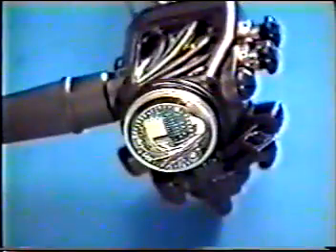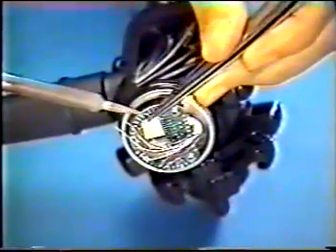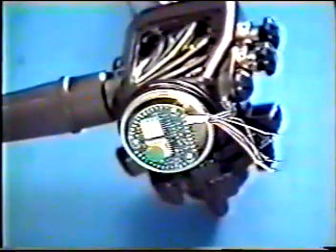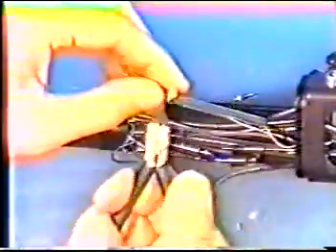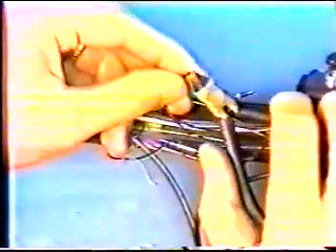Cut 2 grounding wires at the terminal. Unsolder the lead wires on the relay board from the camera head assembly, CHA. This is the relay board unsoldered. Cut black wires at the joint, which are connected to meshed shield of CHA and setup board cables.